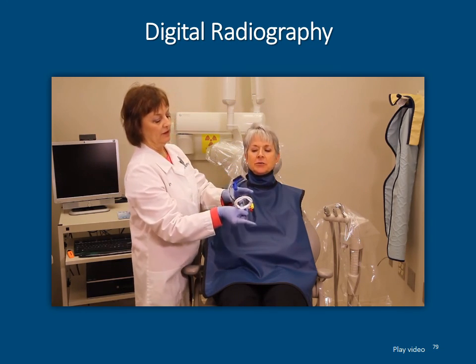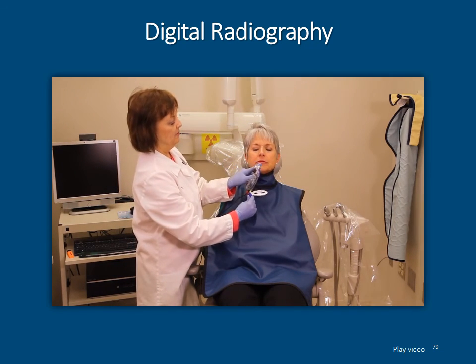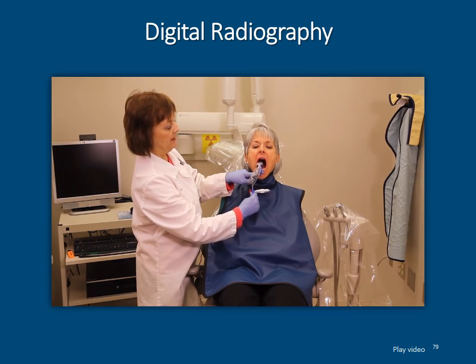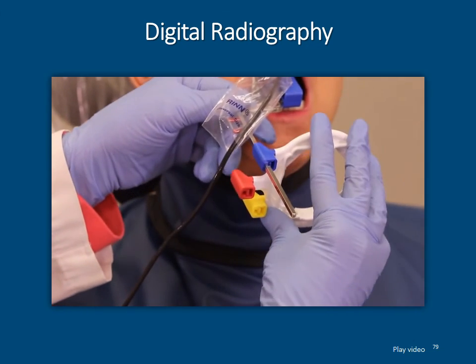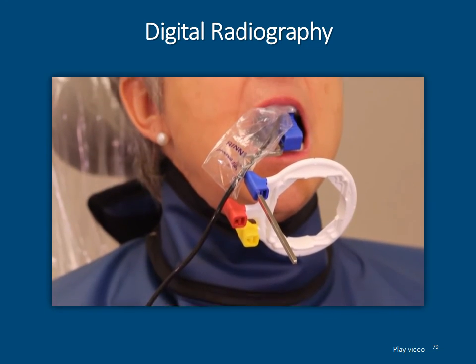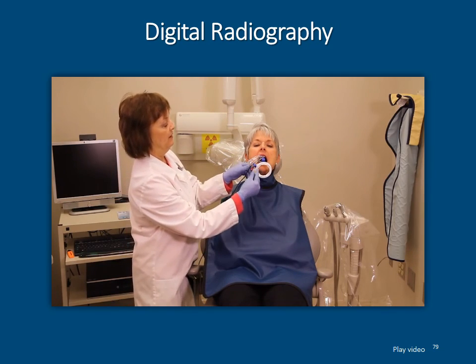Open. You'll just need to reverse it to do the lower two. You're going to take this base, put it between the arch as far back as you can so that it fits, roll the bar up, and then have her gently bite. Again, slide this up, bring your cone in, and follow the direction of the bar with your cone.